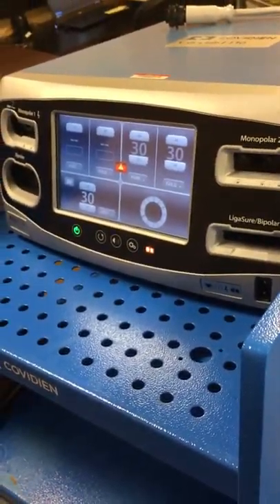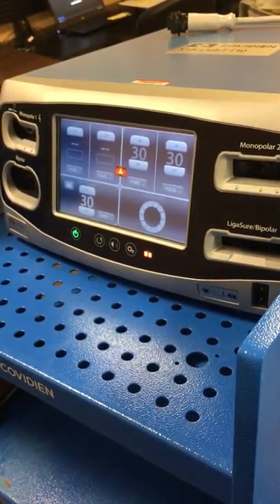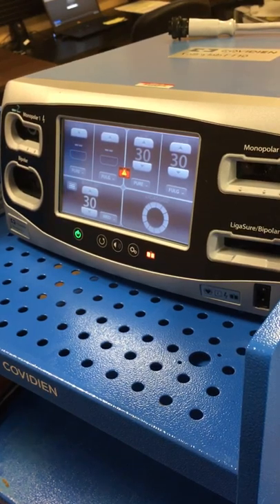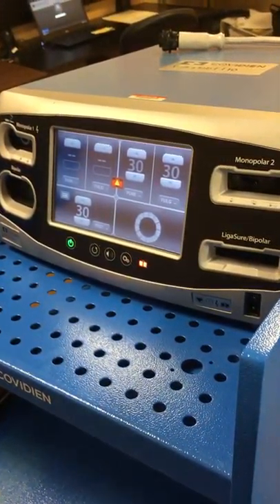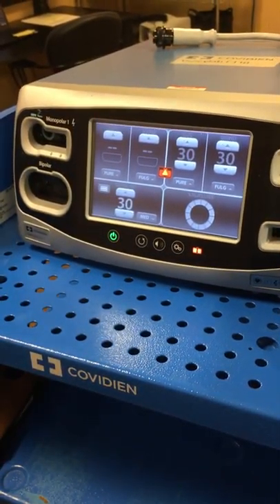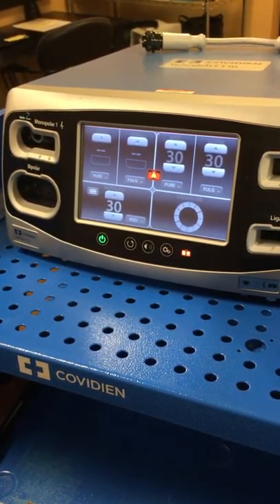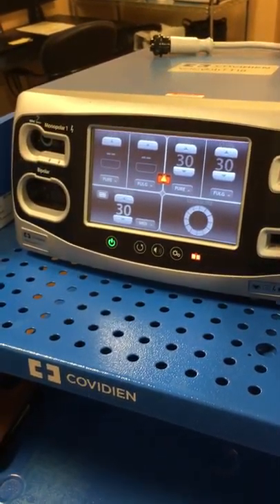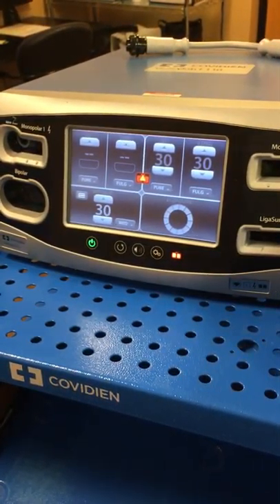It's much more consistent energy delivery than the previous version, which is called the Force Triad. You may be familiar with that already. The Force Triad would make decisions 3,333 times per second. Just to give you a frame of reference on how this machine has been enhanced, the FT10 makes decisions 434,000 times per second, so it's got excellent and very consistent energy delivery.